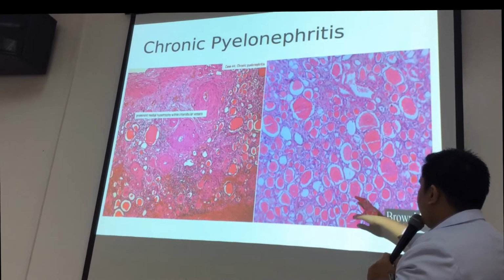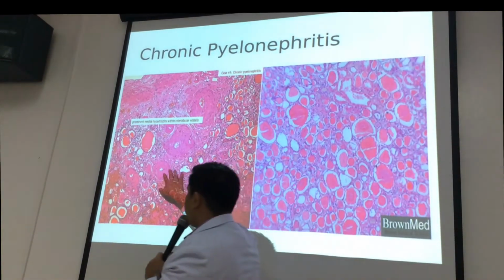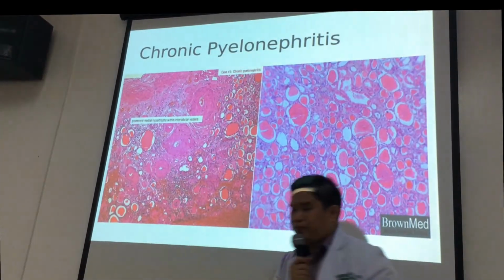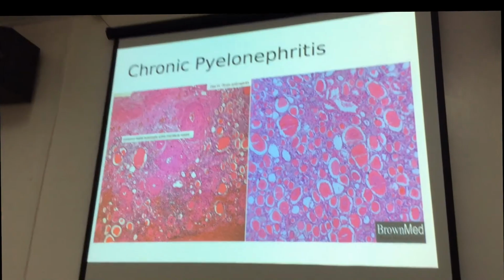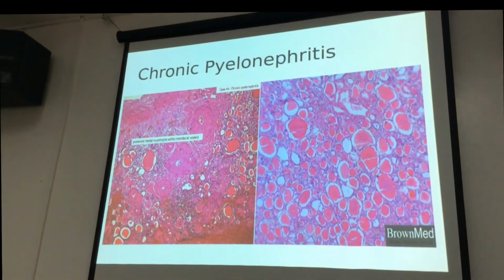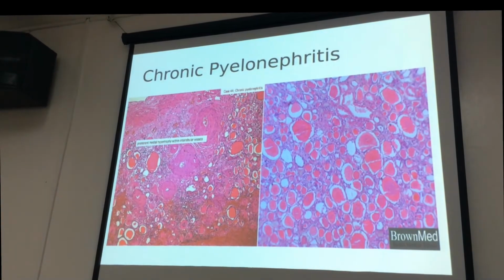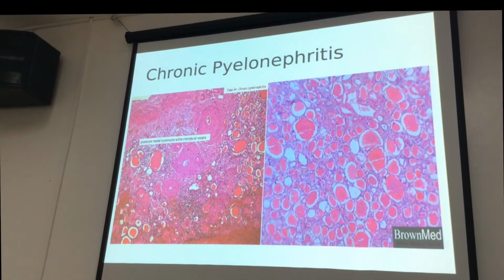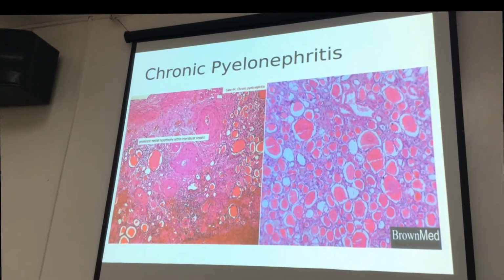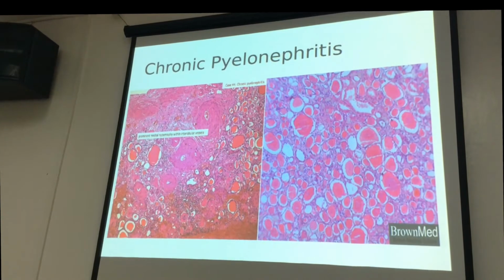Another thing is, aside from the thyroidization of your renal tubules, the presence of this homogeneous pink material being extruded by the injured renal tubular cells, you will also notice thickening of the blood vessels or hypertrophy, particularly the muscle part or the medial part of the blood vessels, medial hypertrophy. Diba? Because of fibrous tissue contraction, this will cause a decrease in the caliber of the blood vessels.